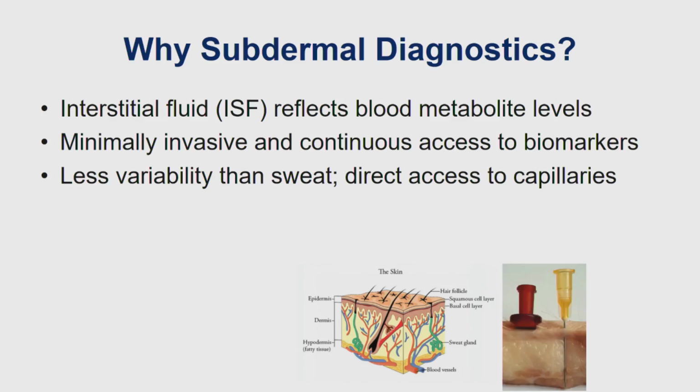So first of all, the question that we ask is, why do we need subdermal diagnostics? What's the difference between epidermal and subdermal diagnostics? Well, if you look at this microanatomy of the skin, in the case of epidermal wearable sensors, you have sweat on the surface of the skin, and that's something that can easily be accessed, not a problem at all. As long as you're sweating, you've got some sample there, so you access that and you can measure things. It's easily accessible. That's a nice thing here.